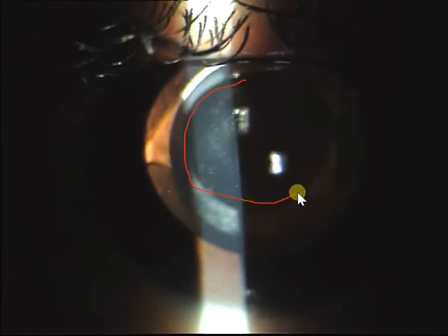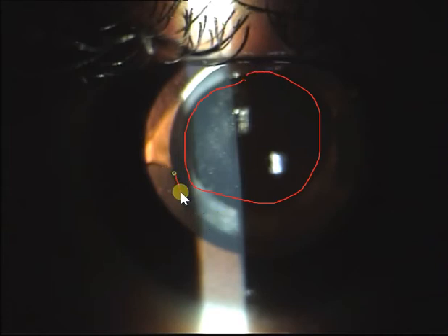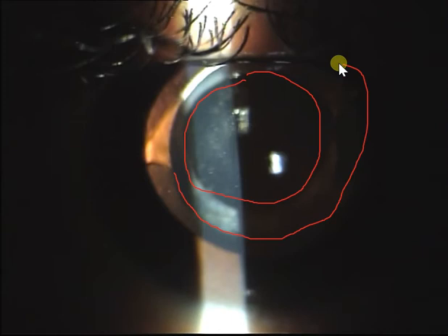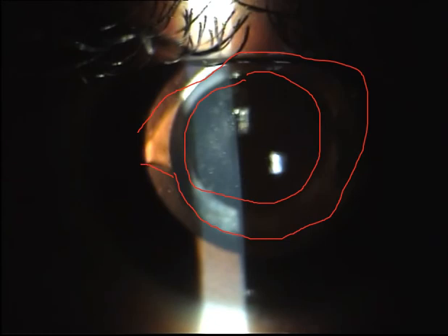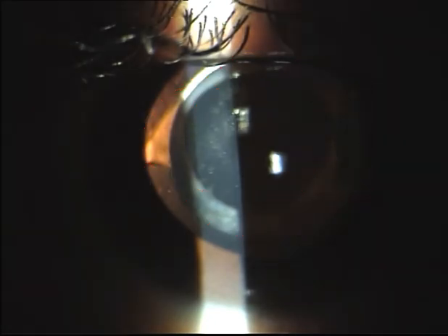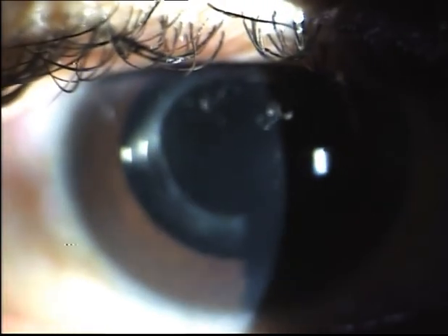This is the capsular opening and this is the optic of the IOL which you're seeing, and this is the red reflex with retro-illumination of the lens — you can also see the haptic. You're making the slit lamp come in at the center and looking through the retro-illumination. Then you can do a broad beam — the pupil is dilated and is not updrawn.